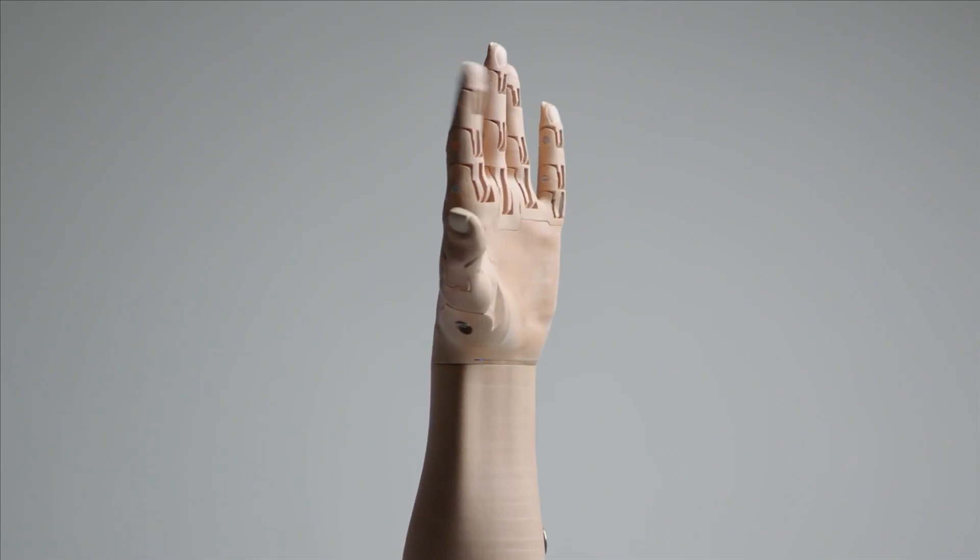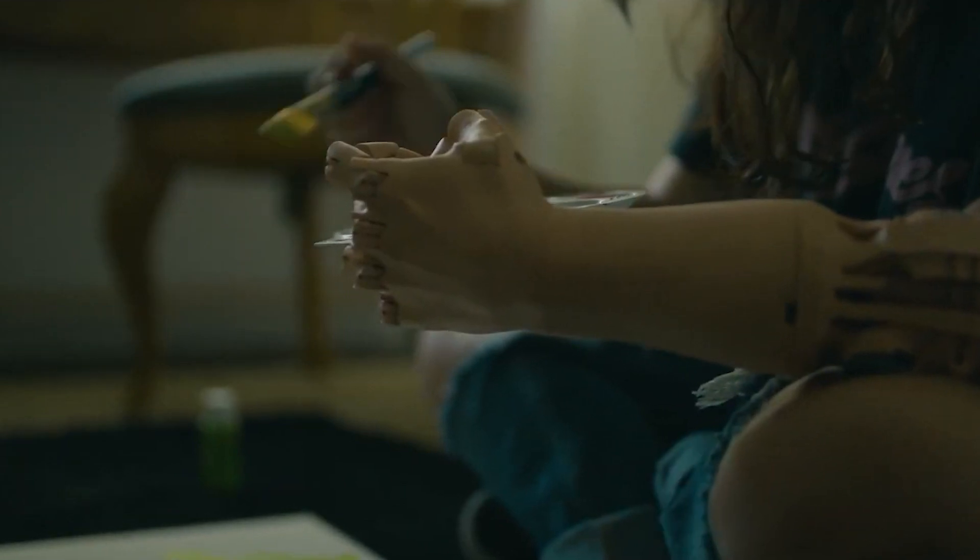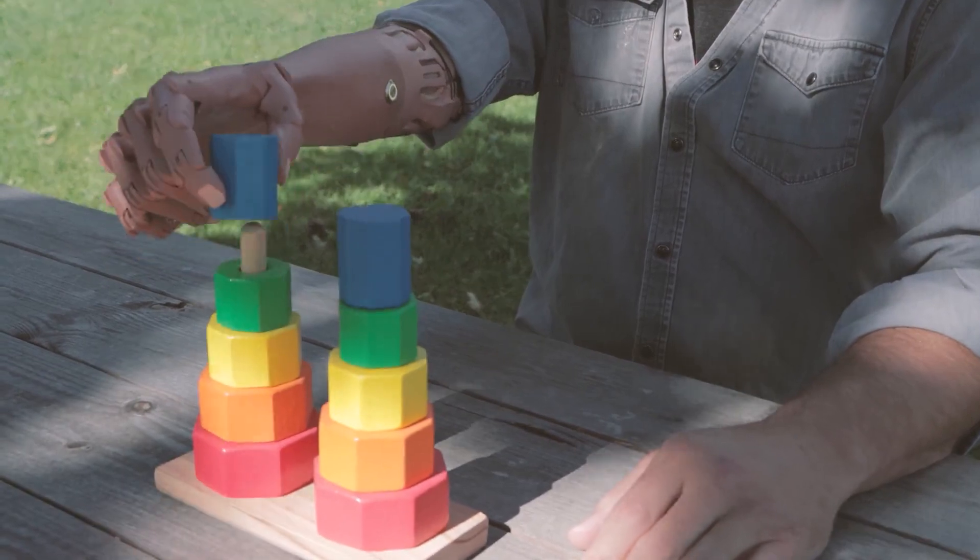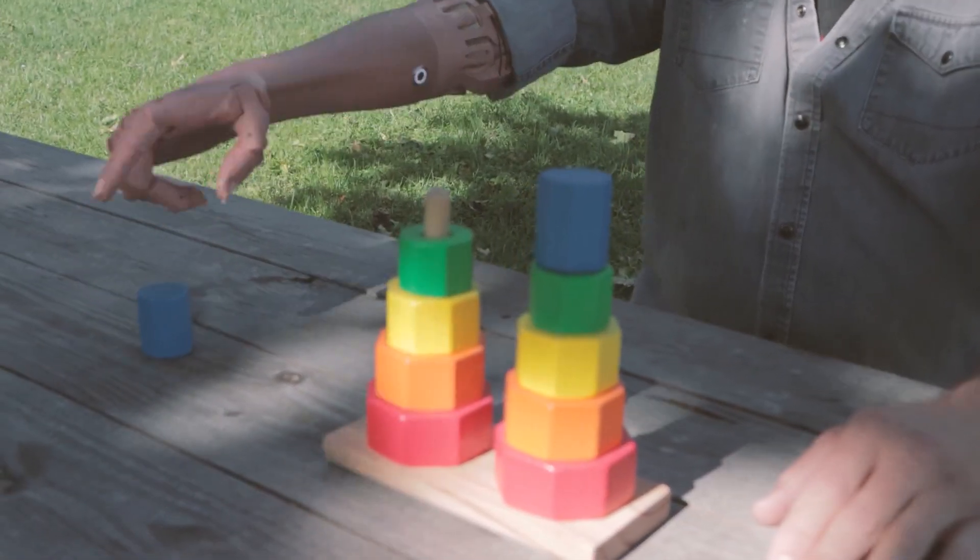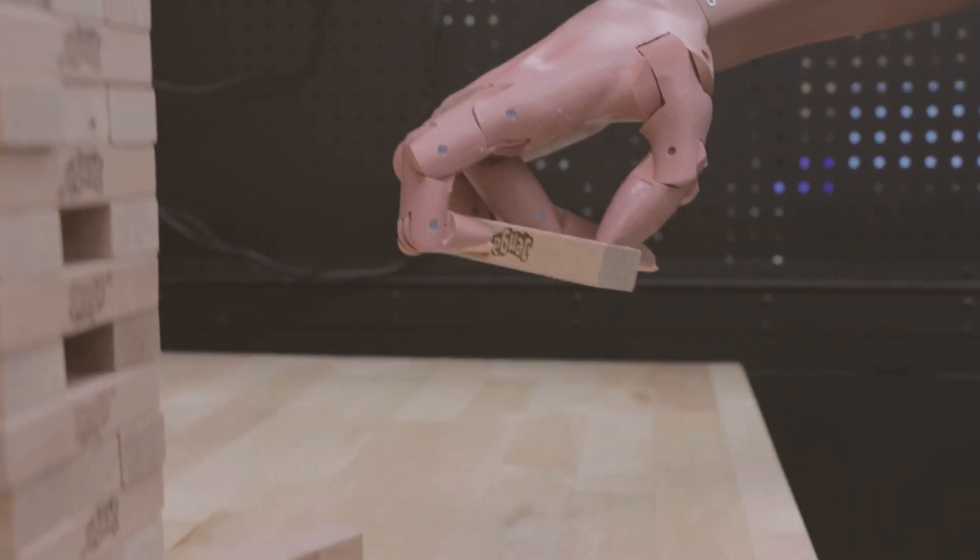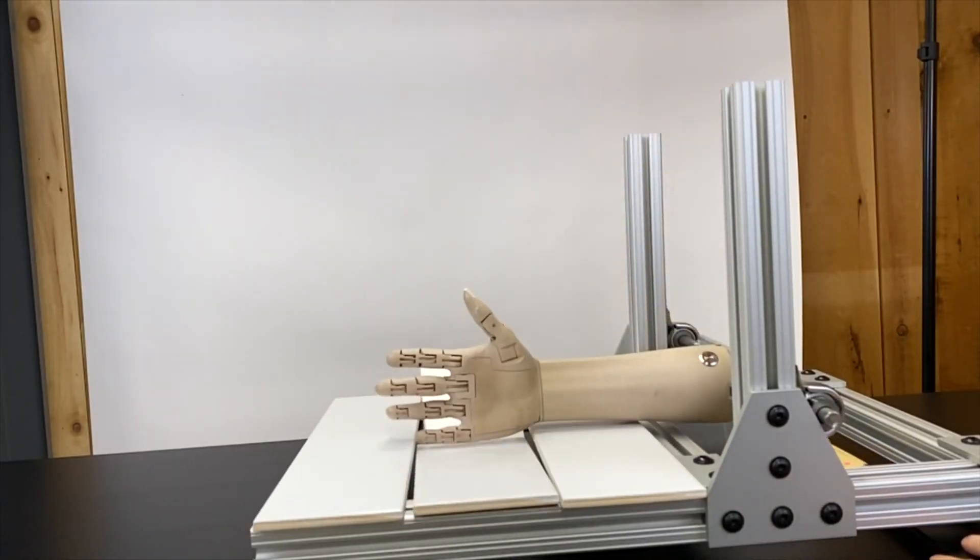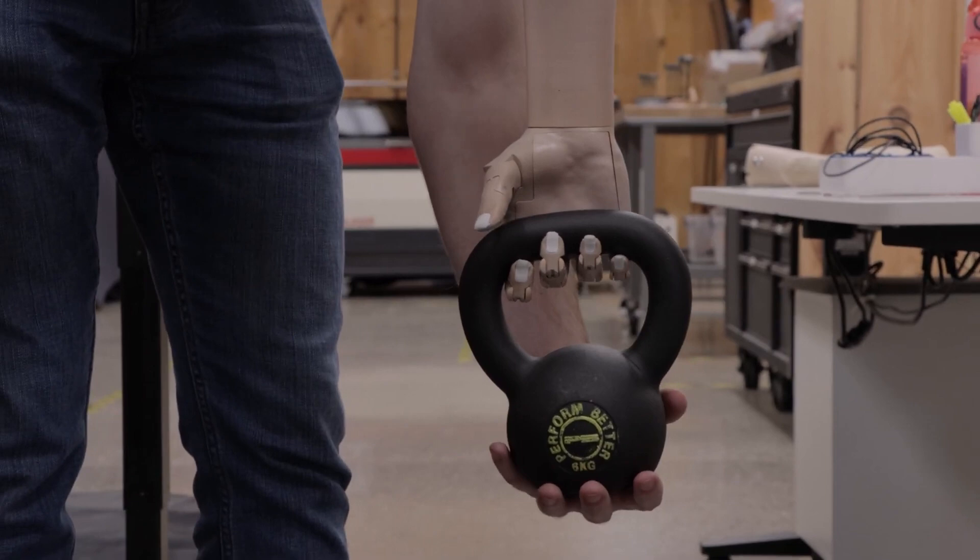According to LaChapelle himself, the TrueLimb prosthesis is not only super customized, but also incredibly comfortable and will almost not attract the attention of others. When creating an artificial arm, skin color, weight, shape, and size are taken into account. What's more, this prosthesis is much stronger than a human hand and can hold up to 22 kilograms of weight.